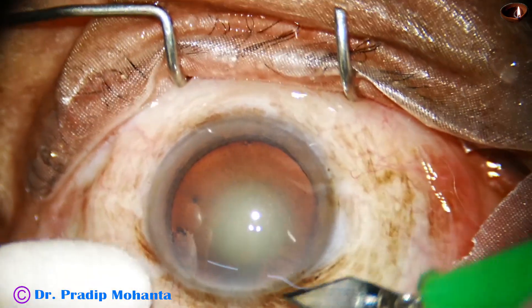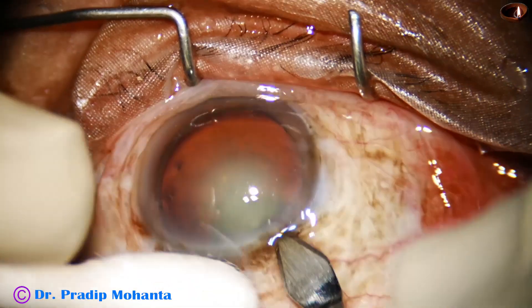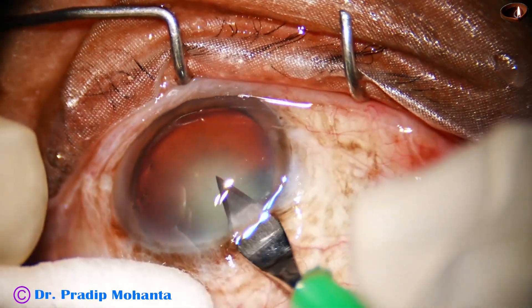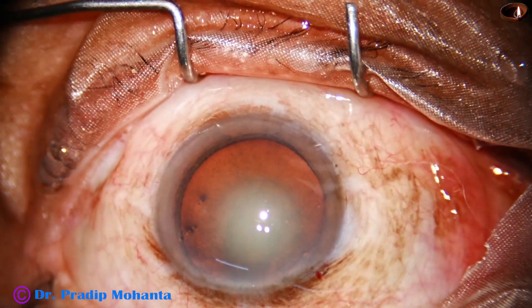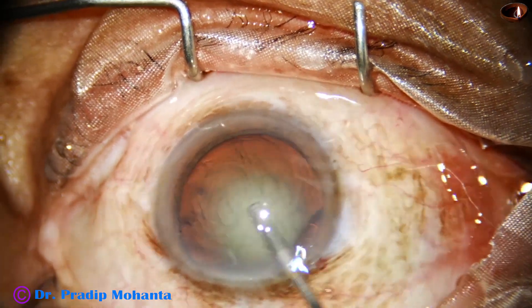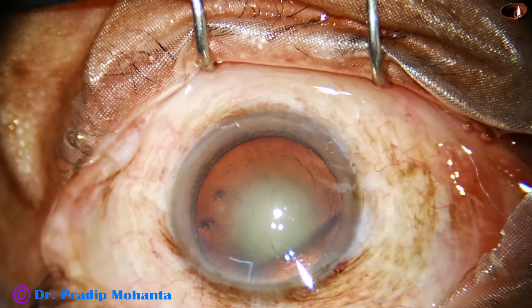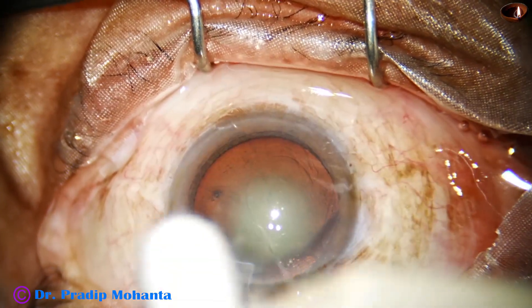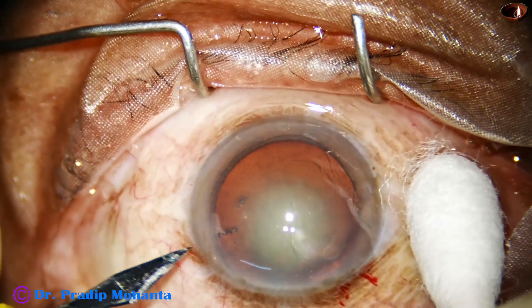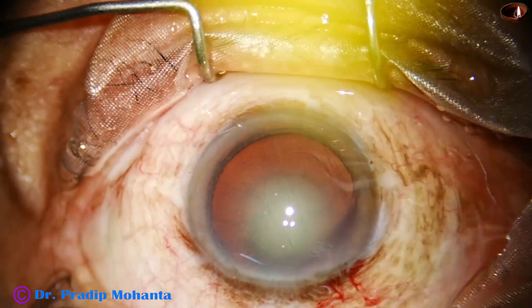You can see this is a cataract with grade 3 nucleus sclerosis. This is the main incision with a 2.8 mm steel keratome. The anterior chamber is filled up with 2% hydroxypropyl methyl cellulose. A side port is made on the left side of the main incision.